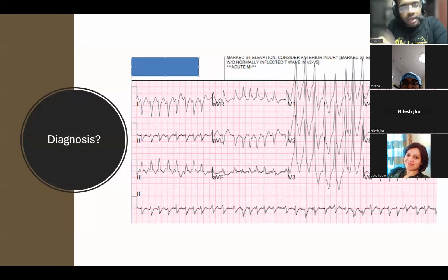So I'll agree that it kind of looks like RBBB, but I'm more interested in something else, and that something else is the rate. What is peculiar about the rate in this ECG? It is extremely fast, extremely fast. You can look at it.